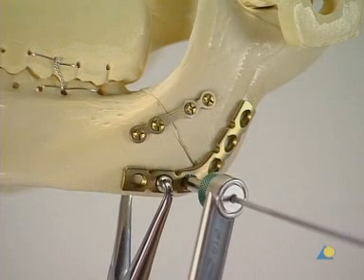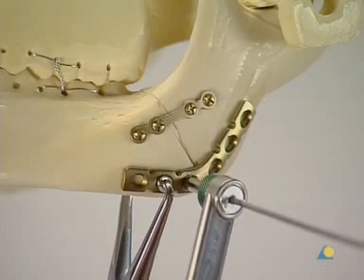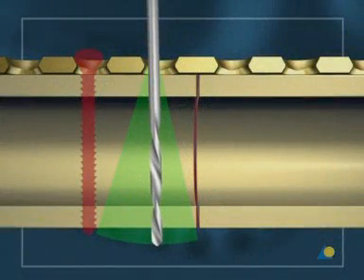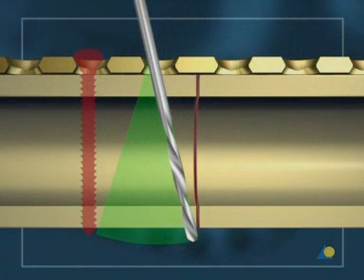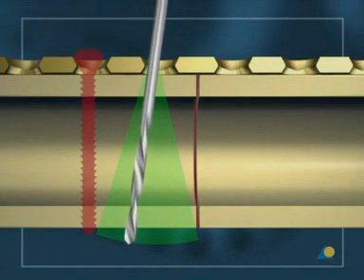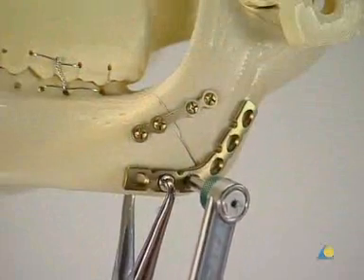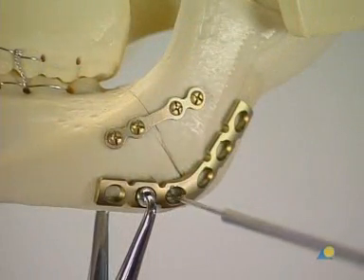The hole should not be too close to the lower mandibular border. Although the hole does not have to be drilled at 90 degrees to the bone, it should not enter the fracture, nor should its angle interfere with adjacent screws. The depth is measured with the depth gauge.